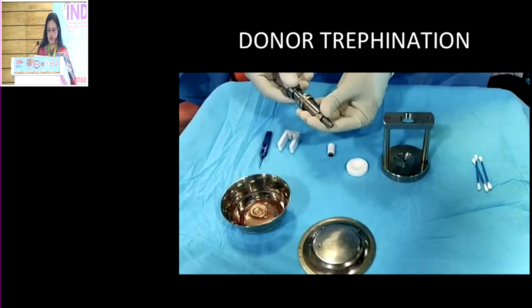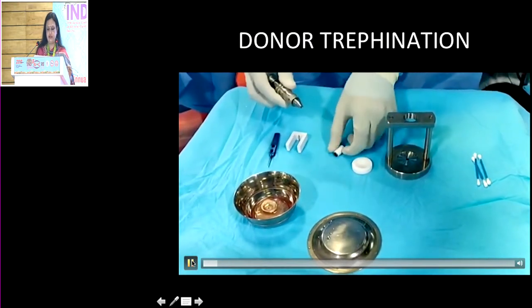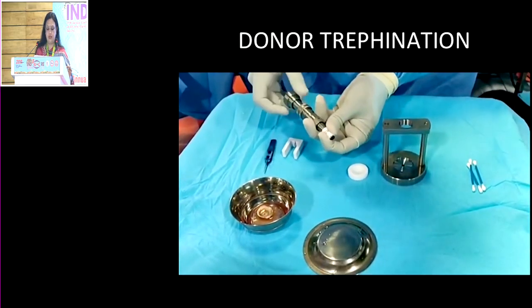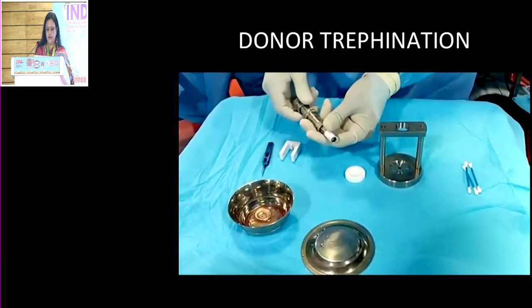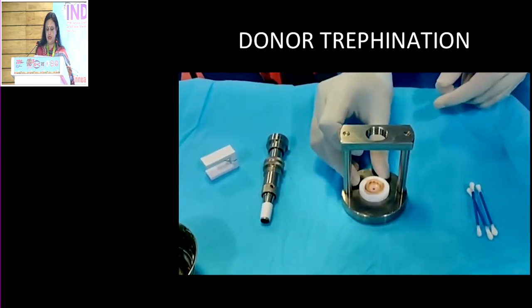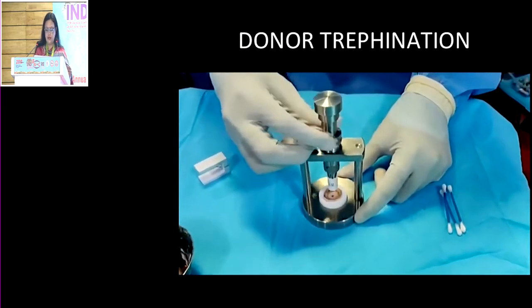This is a video showing how the eye is being prepared. This is a manual trephine that I normally use. You load the size of the trephine onto the manual trephine instrument. The corneal rim is kept on the Teflon block.